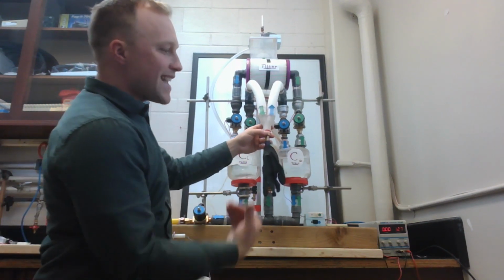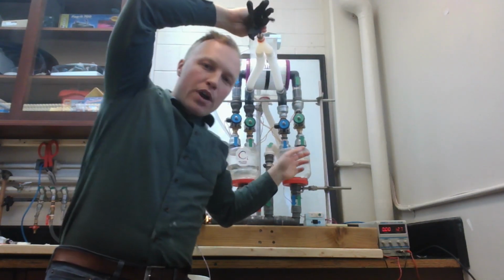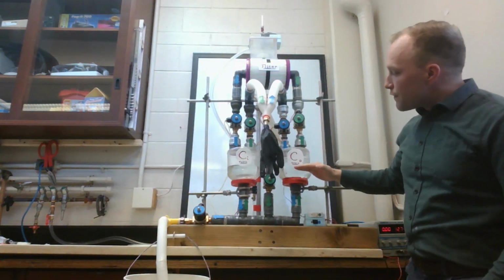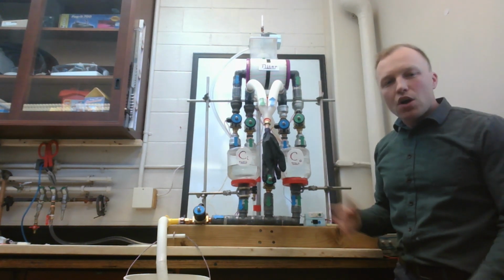Meanwhile, the person is exhaling. The blue line carries air out into the stale cylinder, where that cylinder is filled with air, so that on the next breath, the air can be expelled through the filter. Okay, so let's see it in action.